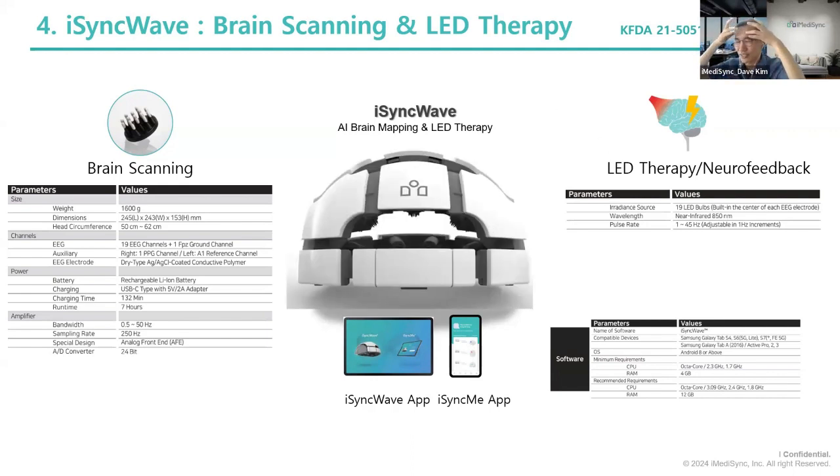Once we align the frontal line and temporal line, the 19 standard positions are automatically set using this special mechanical structure.